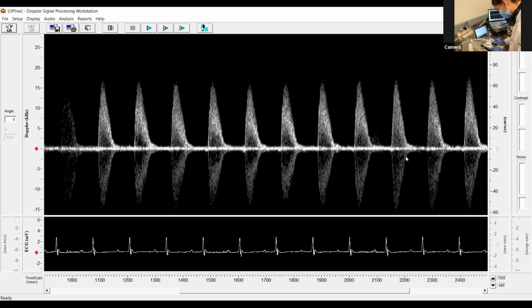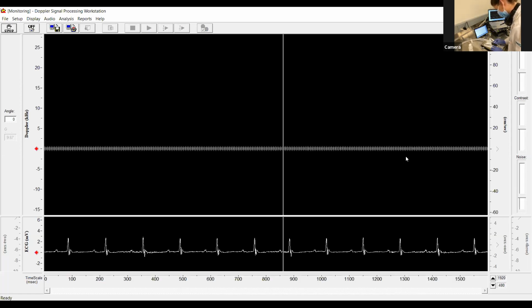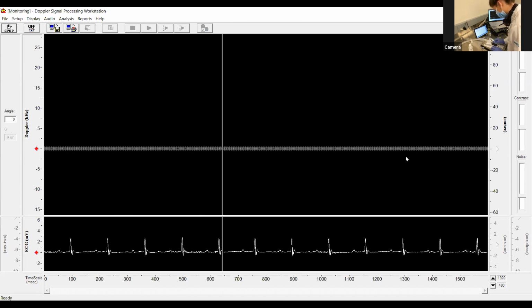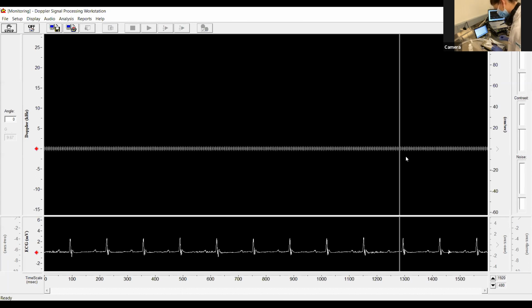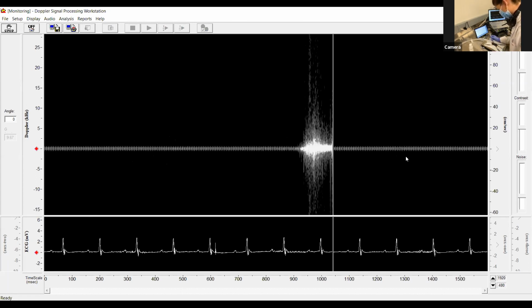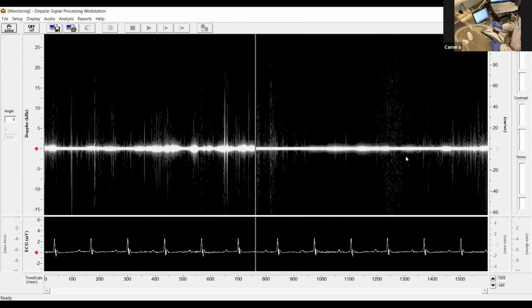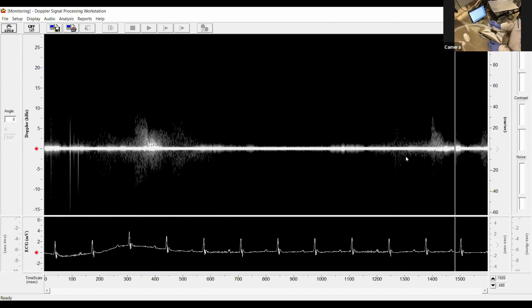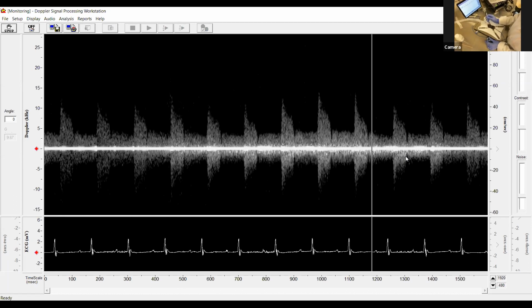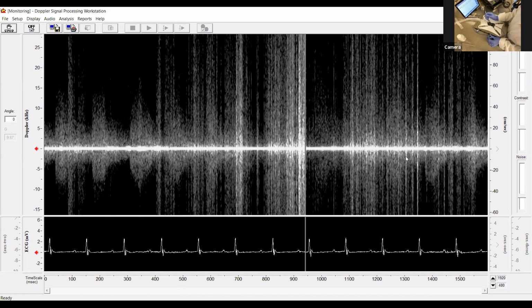With the TAC model, if you were to do the carotid arteries, they should look very different because the TAC should be placed between the innominate and the left common branch of the aortic arch. So if you're looking at the right carotid artery, you would actually see an increase in velocity because the pressure built up by that stenosis is quite strong. And so you'd see an increase in velocity within the innominate artery or the right common carotid artery. You would then see a lower velocity in the left common carotid artery.